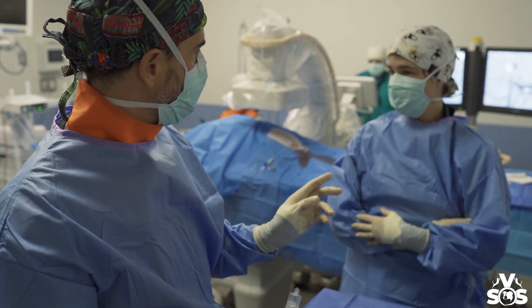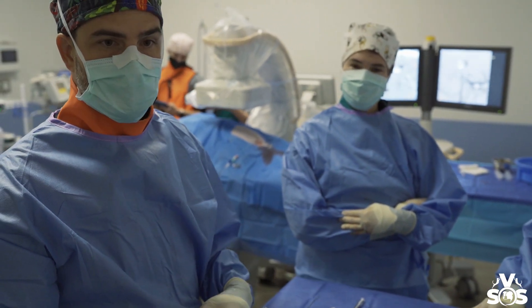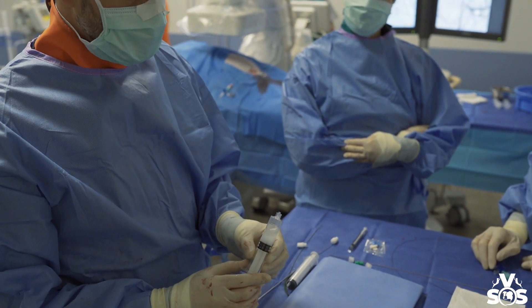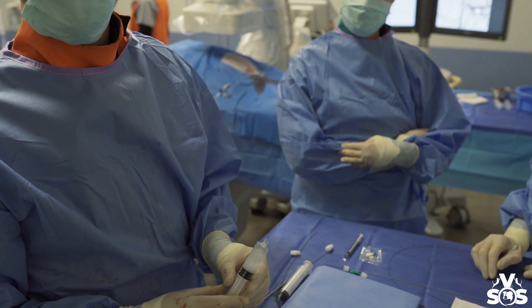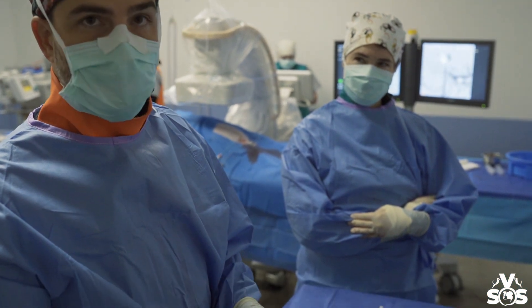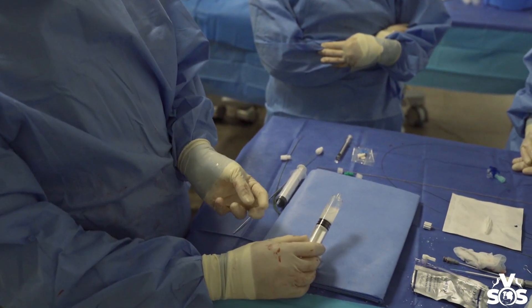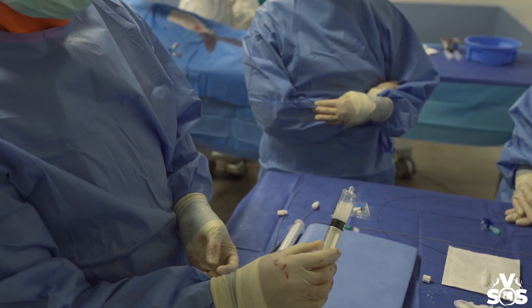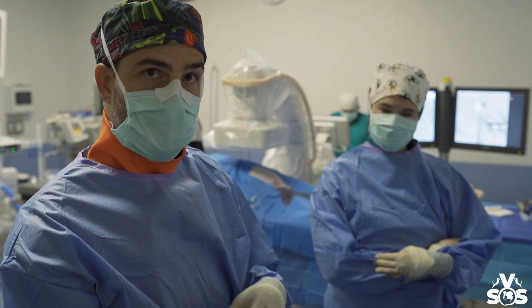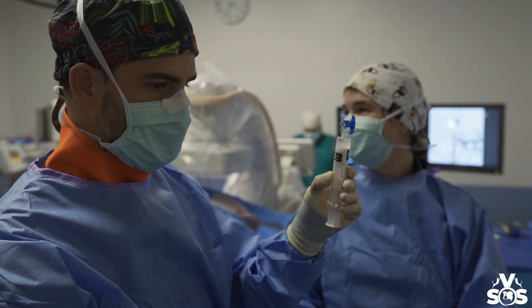We're in a good, safe spot now to target this tumour and embolize some of the blood vessels. What we're going to use today — and what we mostly use for tumour treatments — are so-called spheres: small, tiny, calibrated plastic particles. The ones we're using today are 75 micrometres, so tiny, tiny particles. They give the fluid a milky appearance — it's actually clear fluid, but the white particles make it look milky. We're going to slowly and gently inject these into the bloodstream of the tumour, blocking off the tumour vessels. Hopefully the tumour will then shrink because it gets no blood, no oxygen, and can't survive — so these parts will hopefully die subsequently.